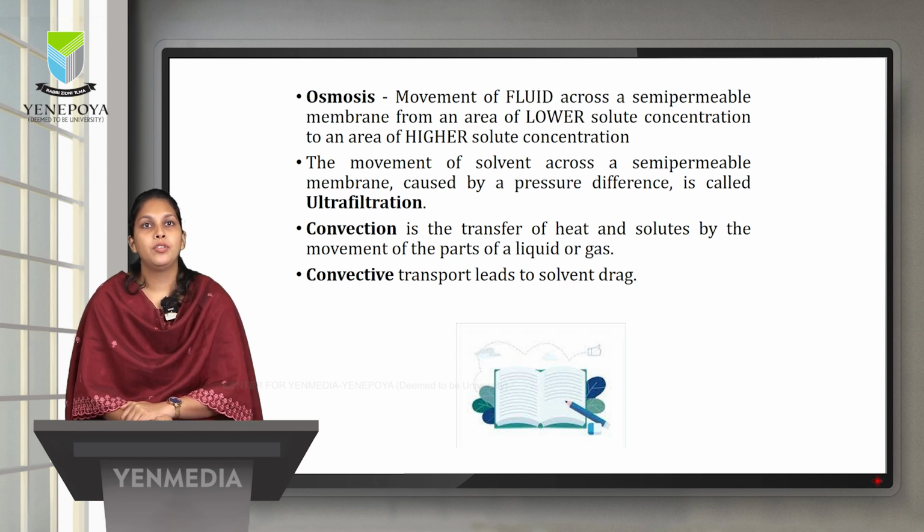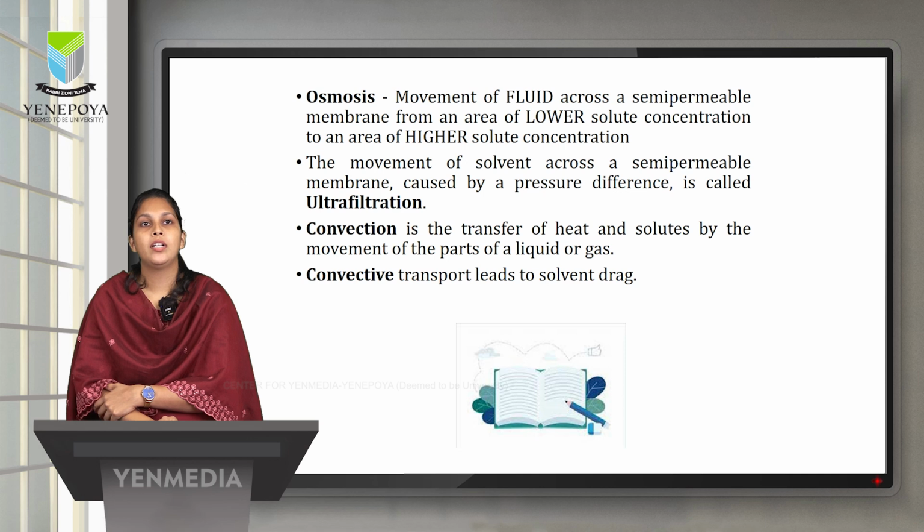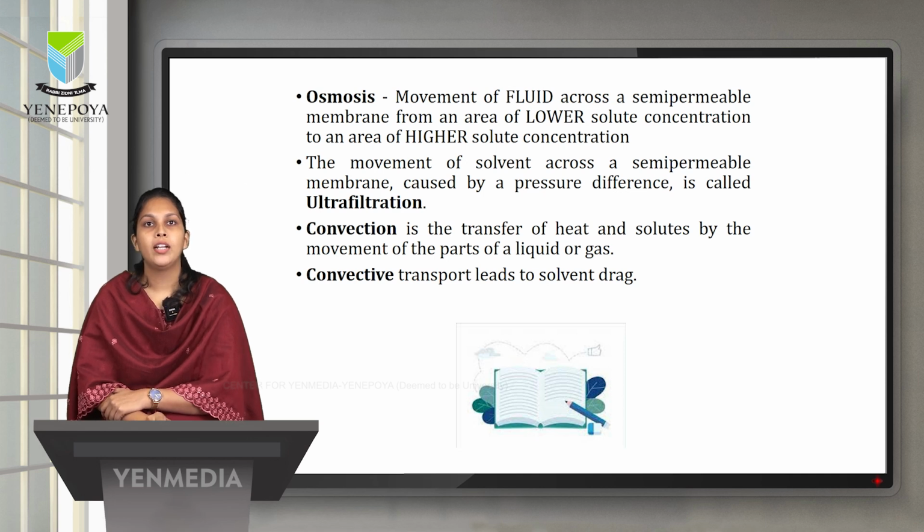The movement of solvent across a semi-permeable membrane caused by a pressure difference is called ultrafiltration. And convection is the transfer of heat and solute by the movement of parts of a liquid or gas. Convective transport in dialysis leads to solvent drag.